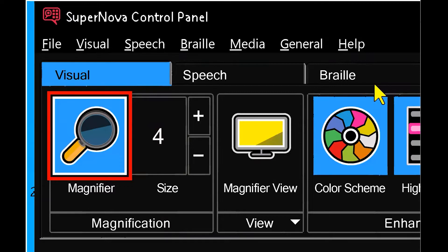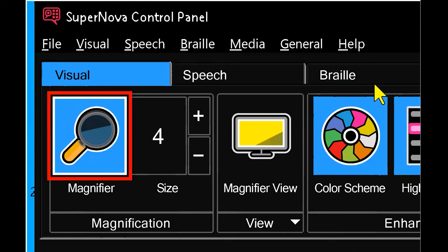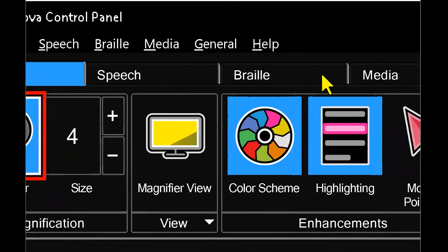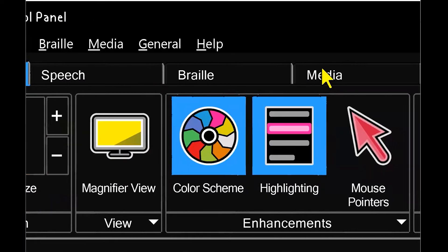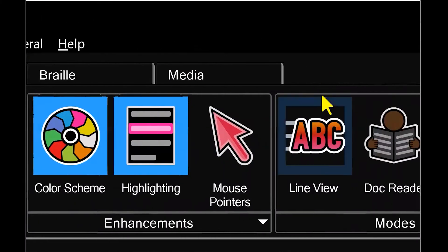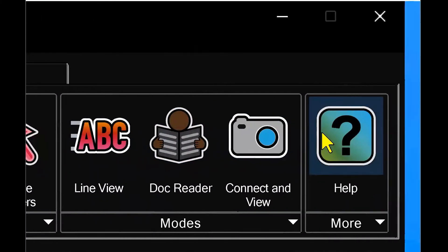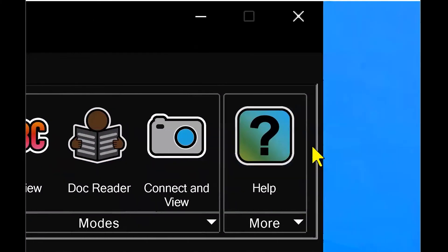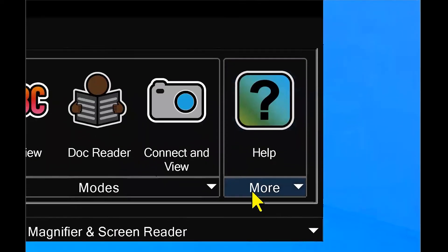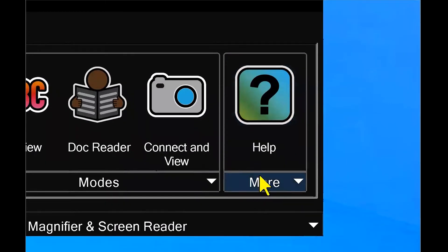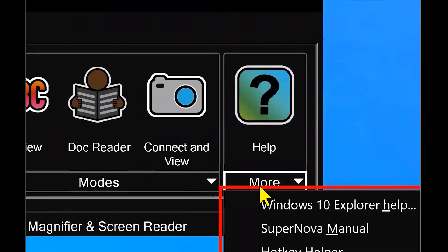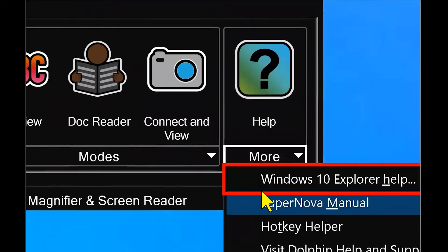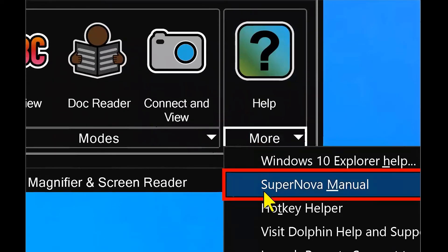On each of your page tabs, whether it's visual, speech, braille or media, you're going to have at the very end of each one of those page tabs is the help button and also a more drop down menu, which mimics the help tab with the omission of the about feature.